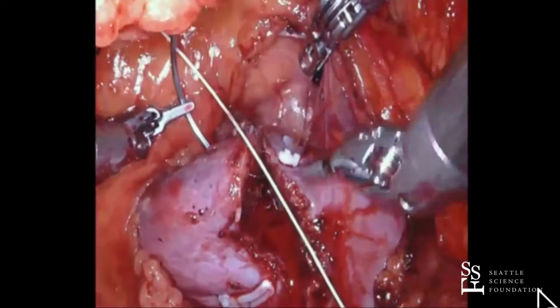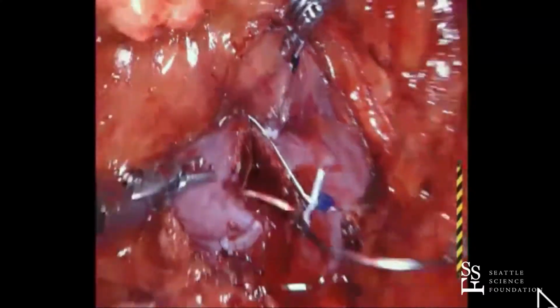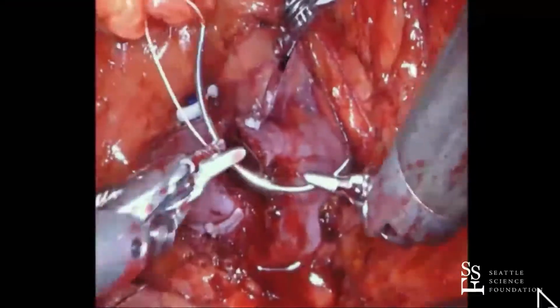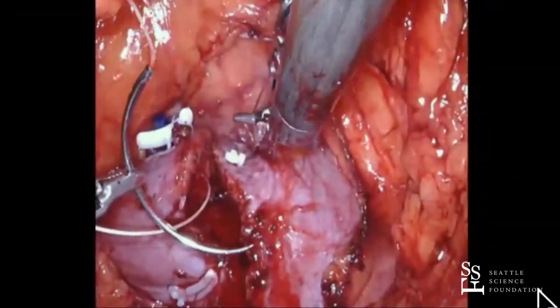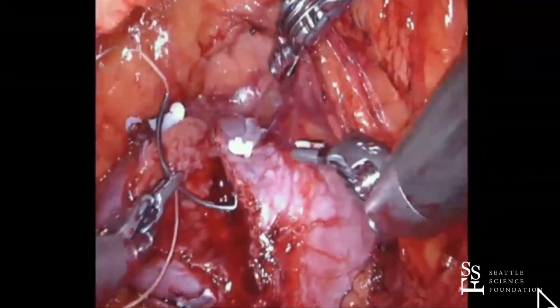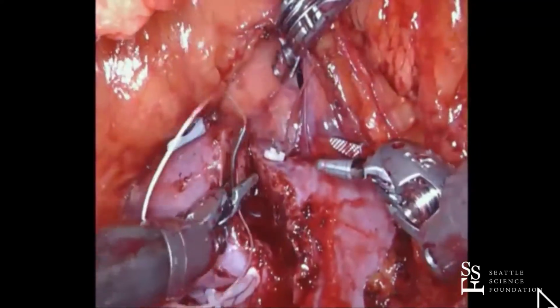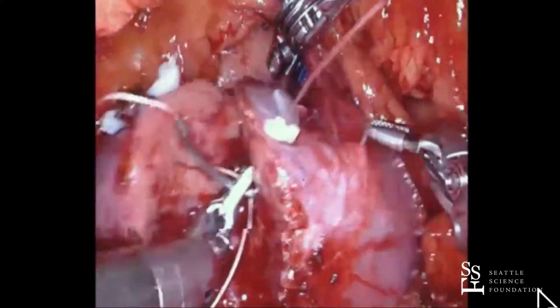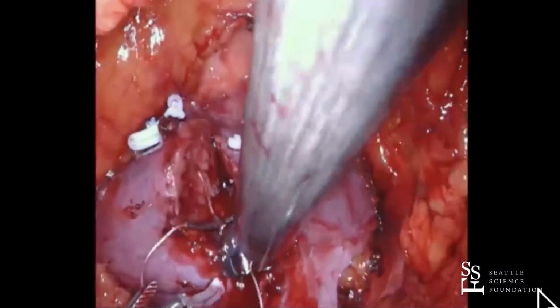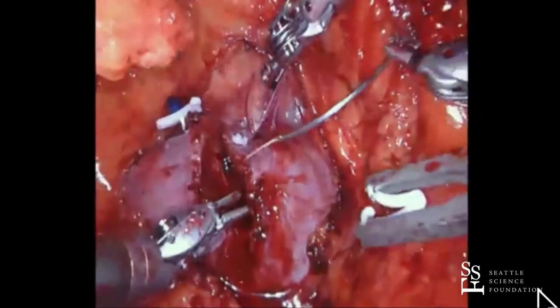So we got this discrepancy here, right? So how are we going to correct that? Well, I'm going to go a little more superficial on this side, and then I'm going to go pretty deep on this side to bring that down. So I'm going to go way down in here. I'm not going to go very far. I'm just going to come straight up. Oh, get back here. My angle's not very good. And that'll bring that down, hopefully.